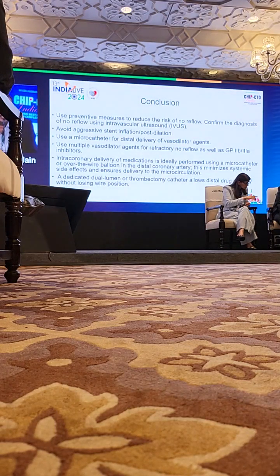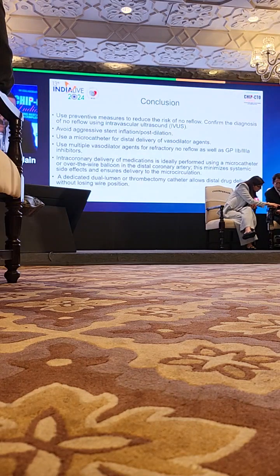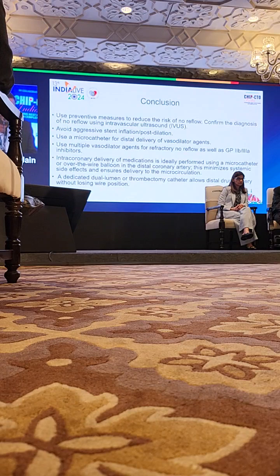The main take-home message from this case is that when you take a complex case with a lot of calcium and a lot of modifying techniques, you should always keep in mind that no reflow phenomenon can happen. It is never straightforward until the end, and a complication can happen at any point of time. With this, thank you.